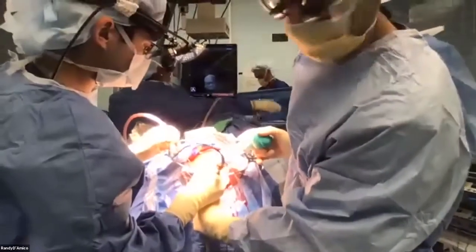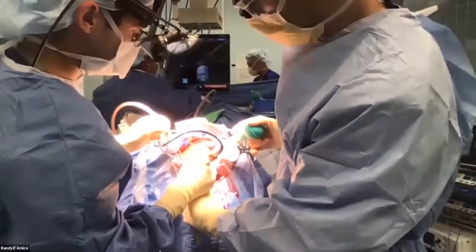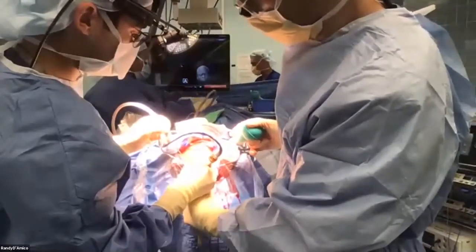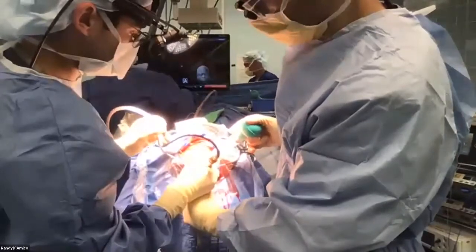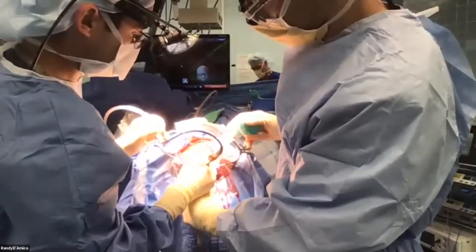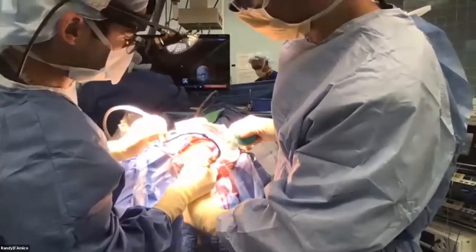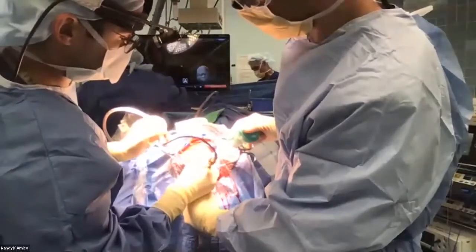We have to do a few slots over the big vein, and then a burr hole probably. And then we'll take the bone off. Now the bone is going to be attached to the tumor, as you can tell by the way that it's grown through it a little bit. Try to make it just the width of the burr. Once you're under the cortical bone, then you can widen underneath, and that way the closure is nicer.